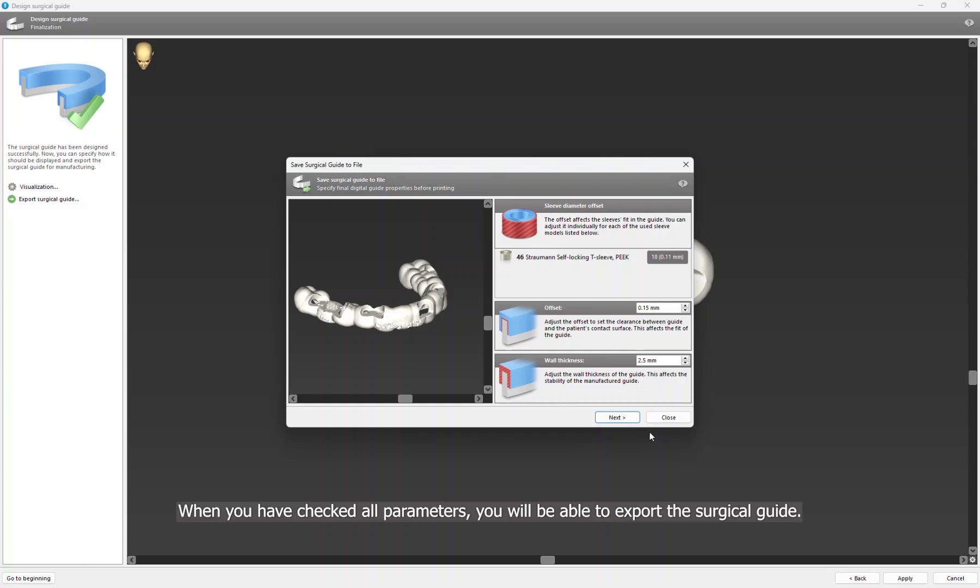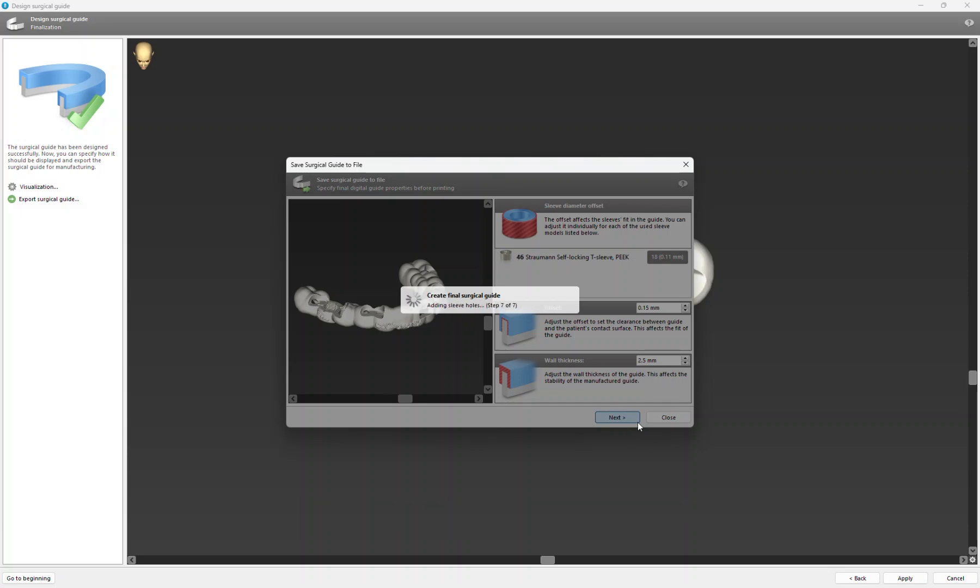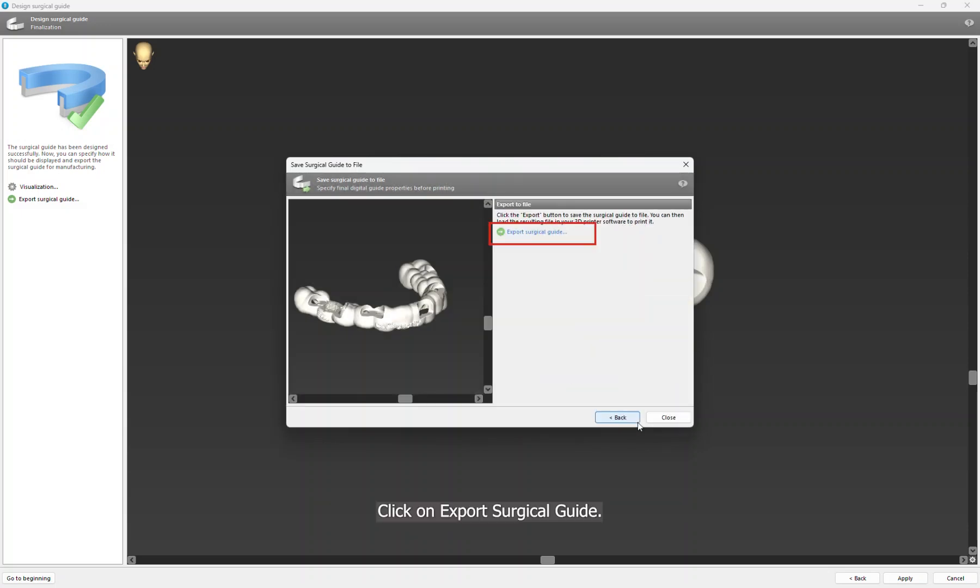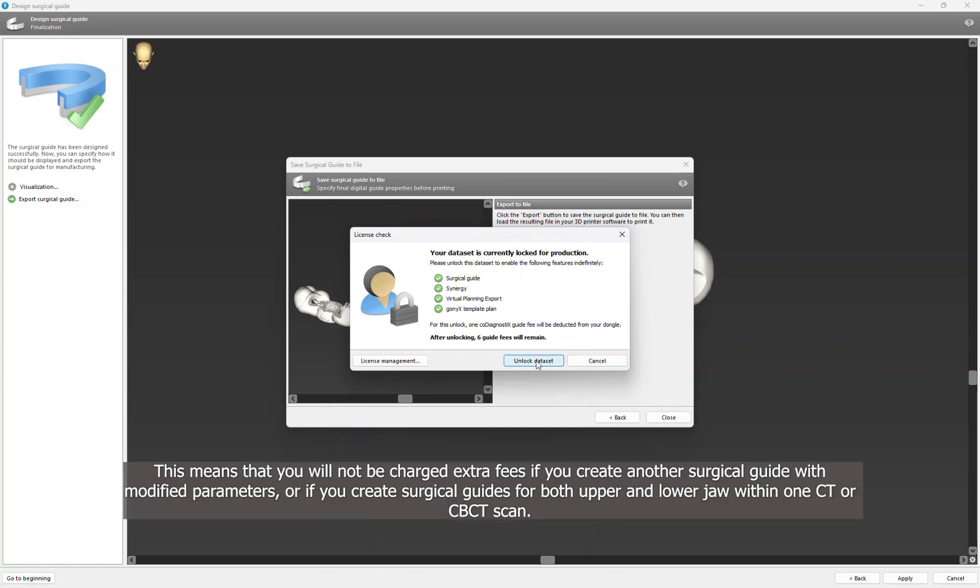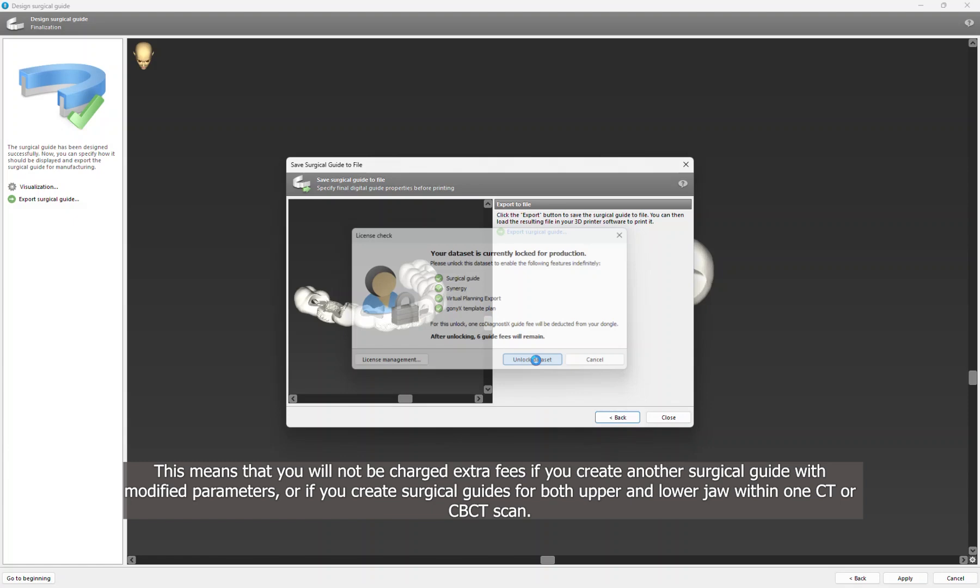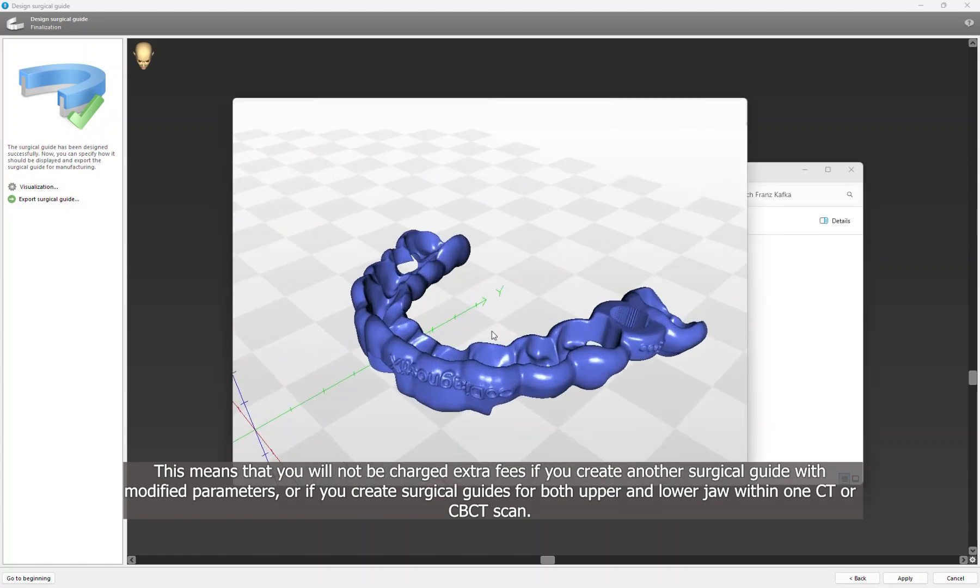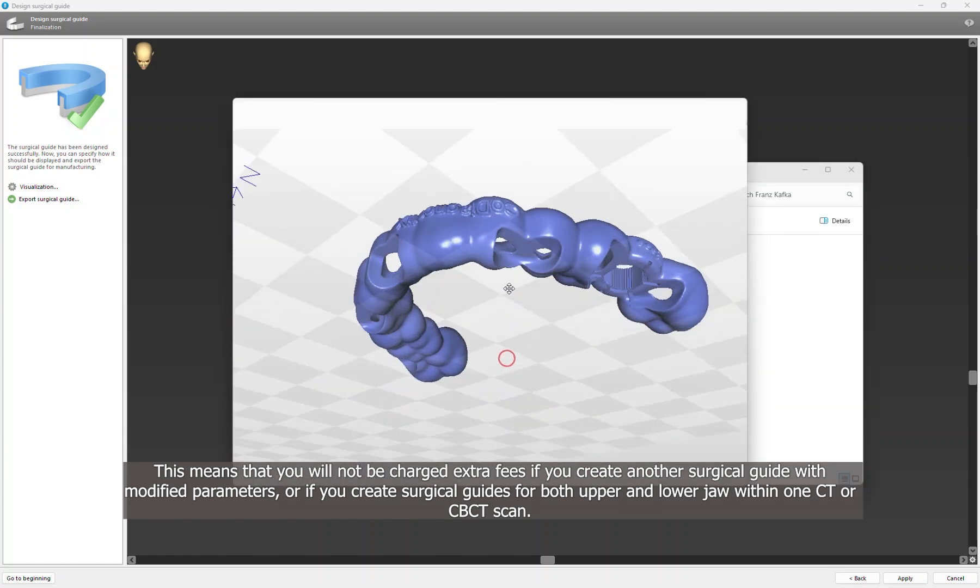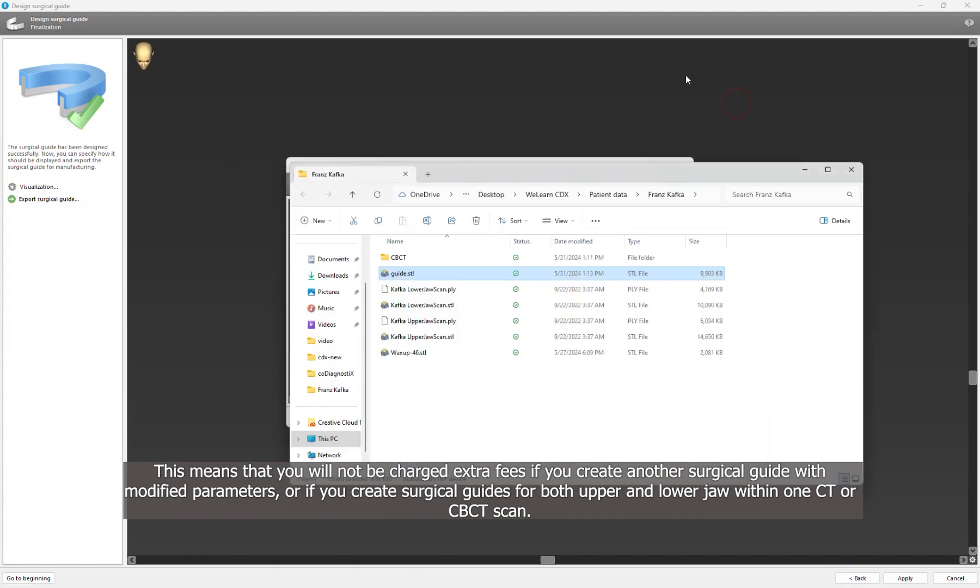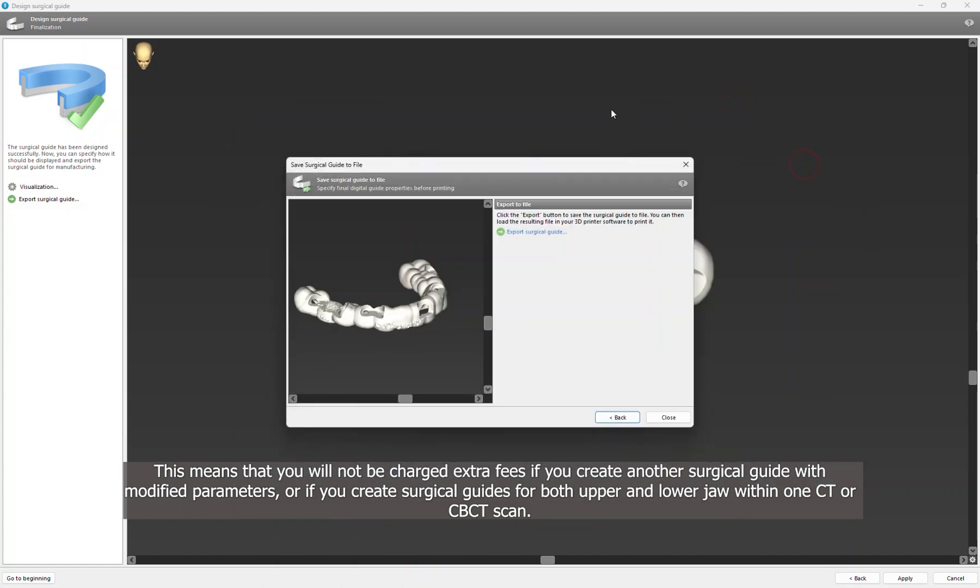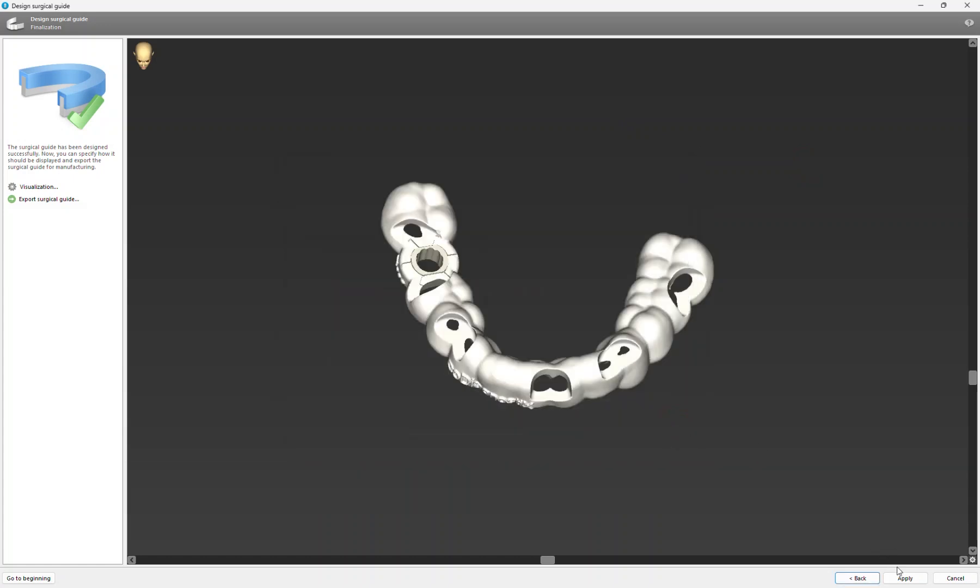When you have checked all parameters, you will be able to export the surgical guide. Click on Export Surgical Guide. Now you need to unlock the planning. A click fee will only be deducted once per case. This means that you will not be charged extra fees if you create another surgical guide with modified parameters, or if you create surgical guides for both upper and lower jaw within one CT or CBCT scan.